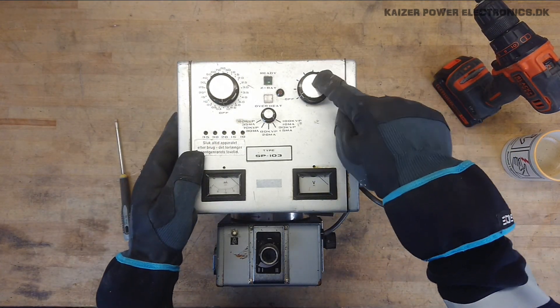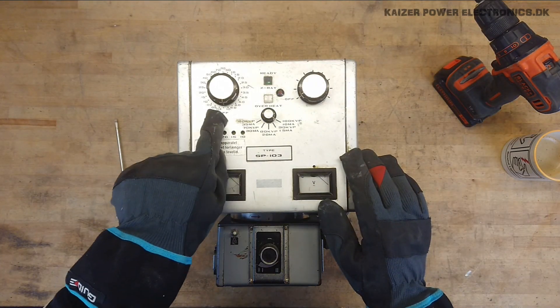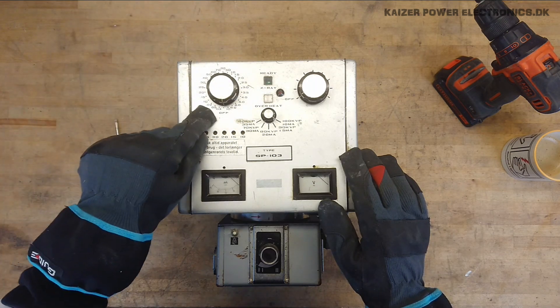We have two off switches. Not quite sure why, because this one has no markings. So it just has a lot of settings here, whereas the other one has second settings. So this is exposure time.